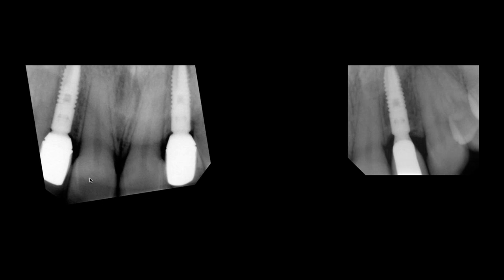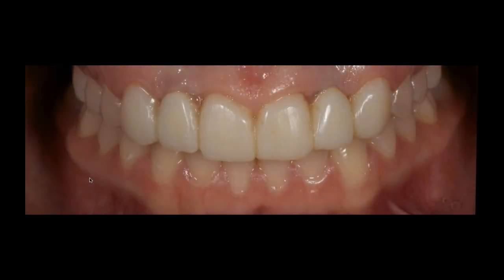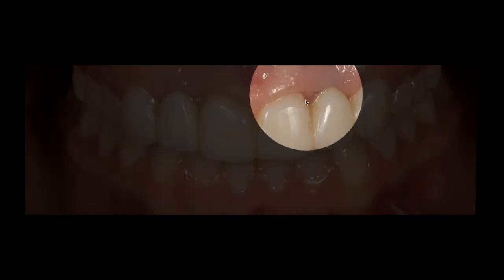So what we actually did was we removed those abutments and we basically ground them down, the custom made abutments that the company had made for us, and we made them into little thin sticks, a little thin ice cream cones, you could say. And then made new temporary cylinders for them. And you can see how we're kind of just creating some space underneath the tissue and allowing the bone to heal up and grow back the way it should. And this is just after 3 days of cleaning it up. Look at how much more that tissue is starting to drop already.